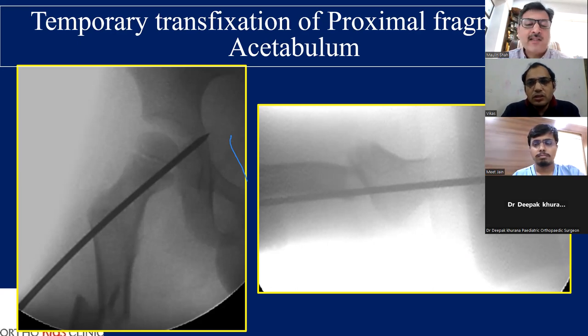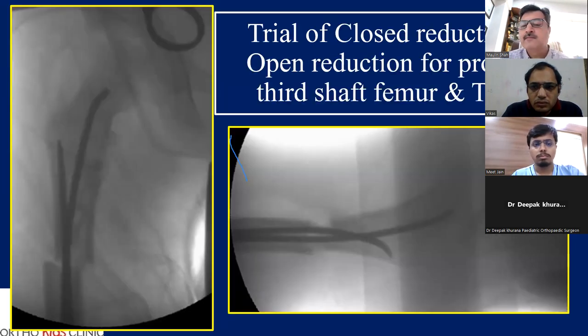So yeah, that's what we did, Gaurav. We opened the fracture. We tried a lot, but we could not reduce it by closed means. We passed the tens from the distal fragment and also manipulated, to see if we could achieve reduction and maneuver one nail through, but it was not going through. So we had to open at the last, as a last resort.